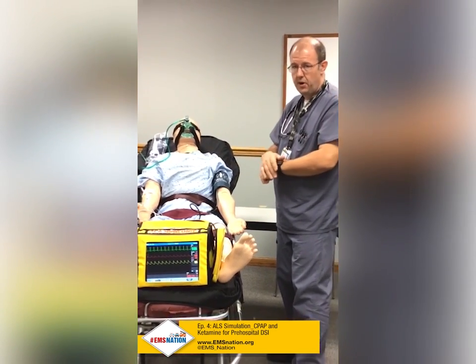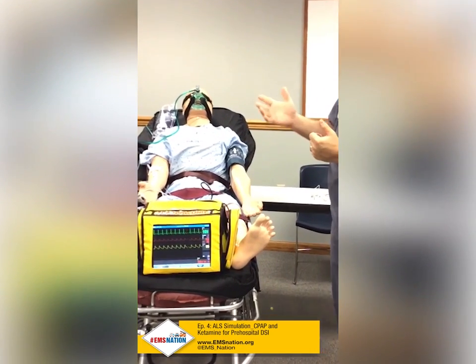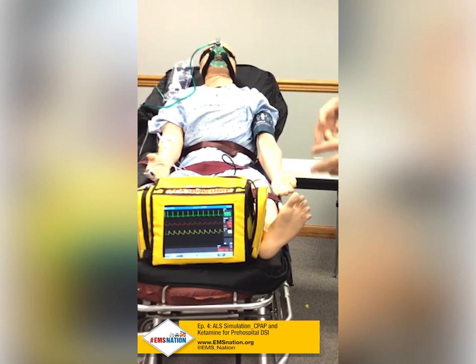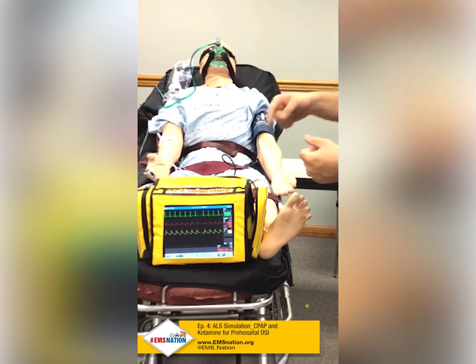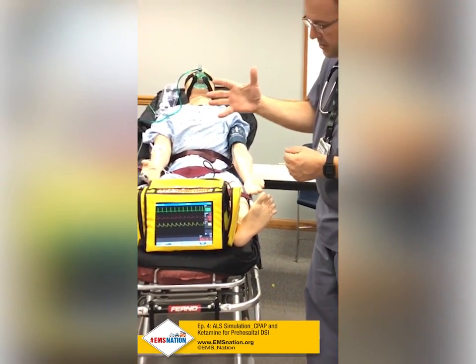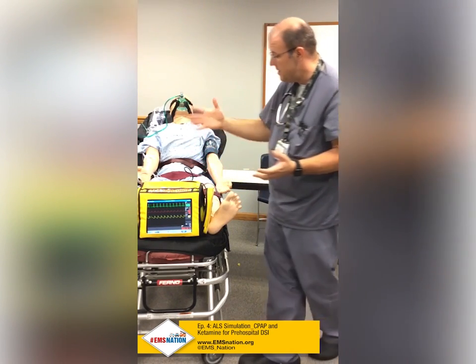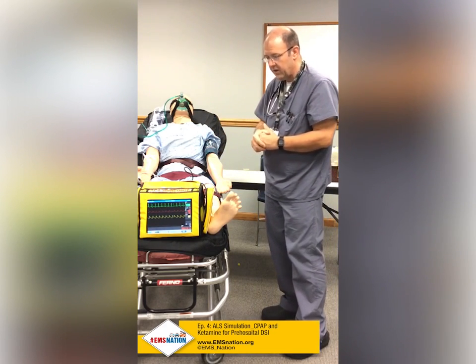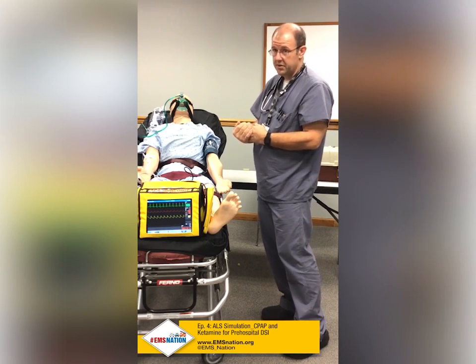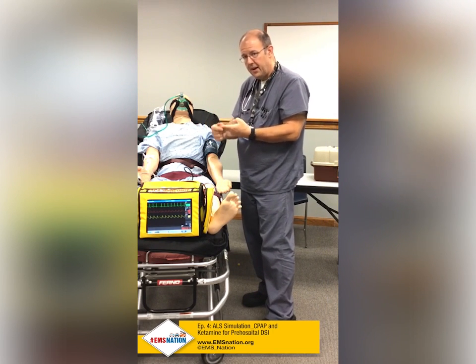We've added PEEP to the scenario using a fixed PEEP device at 10 cmH2O of positive end-expiratory pressure. The patient breathes out against this force to recruit and split open the alveoli, ventilating more of the lung. As we watch the monitor, saturation has come up to 95%. We've come a long way from our initial impression — optimizing oxygenation with fluids, push-dose pressors, and CPAP/PEEP now has the patient ready for an intubation attempt.